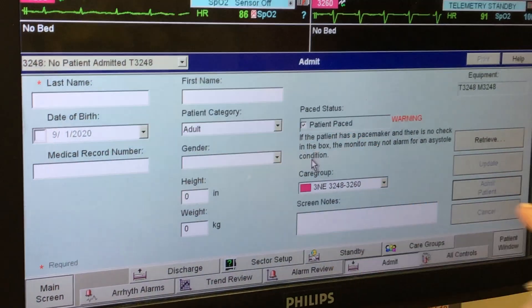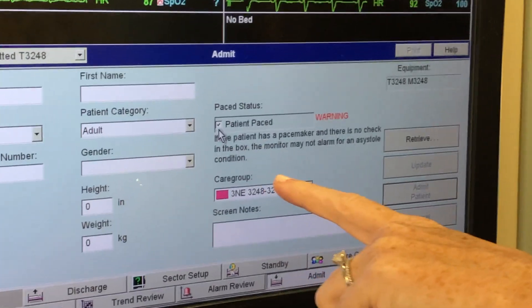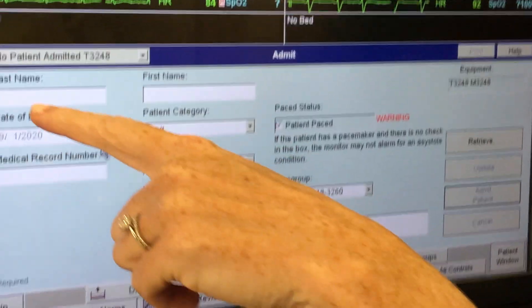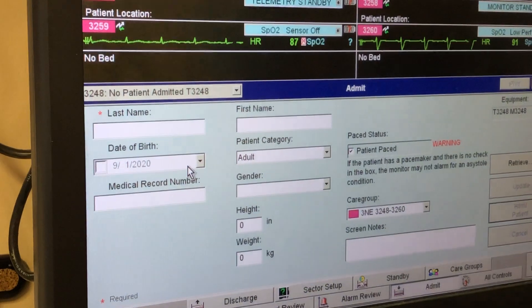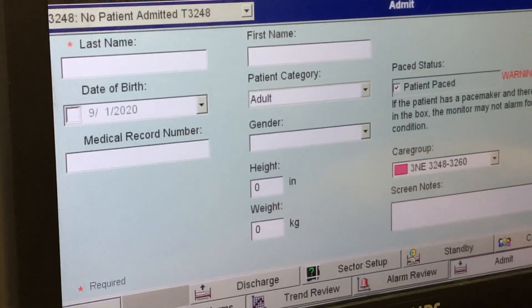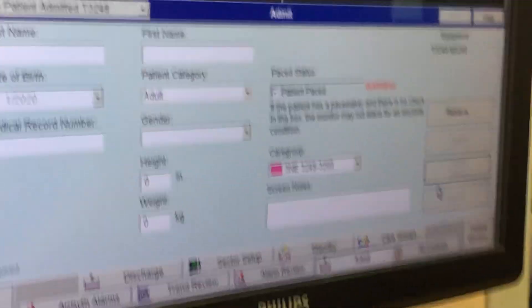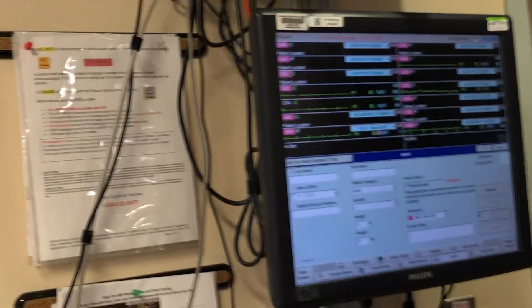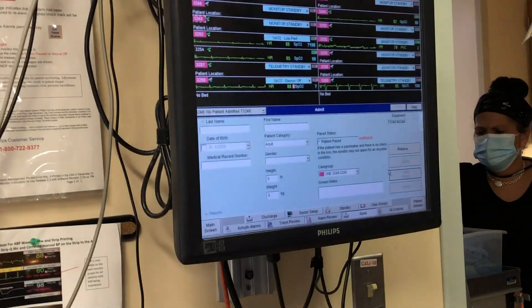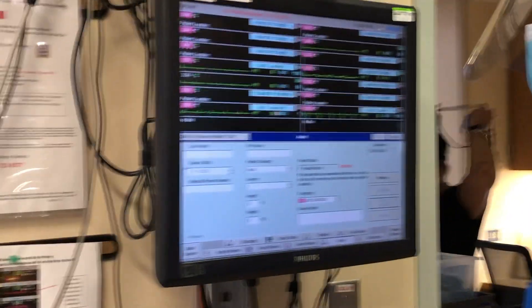This is automatically checked, so you would uncheck it. Put in their last name and first initial, then hit 'Admit Patient.' You don't have to fill in the rest. Make sure you admit them before the patient lands in the room so their vital signs all copy over correctly and pair up together.